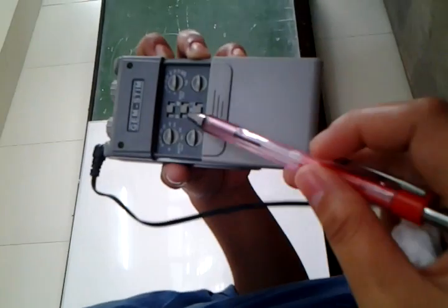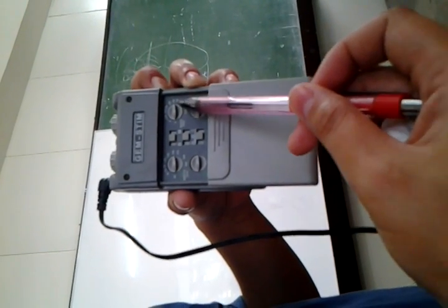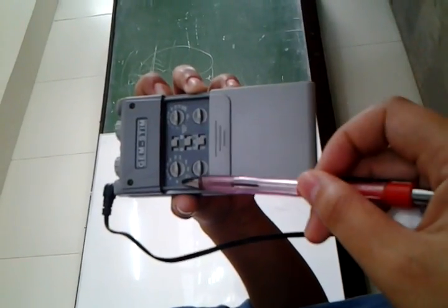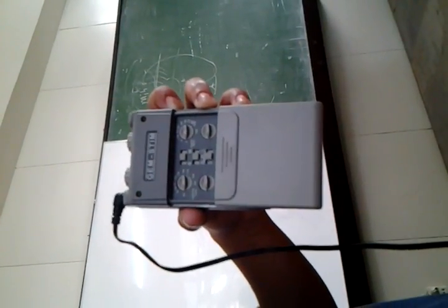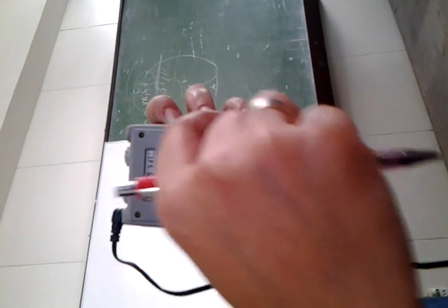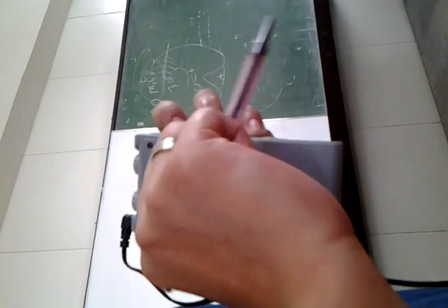Okay? And then on your right, you have the pulse width, and on your left the frequency, which is in hertz, and the pulse width is in microseconds. So basically for your conventional, you can use higher or lower frequency. Usually we use higher frequencies in rehab. Right, Miss Dins? Higher frequencies.